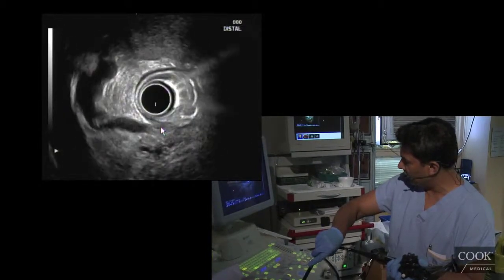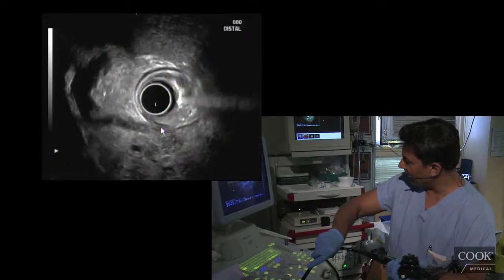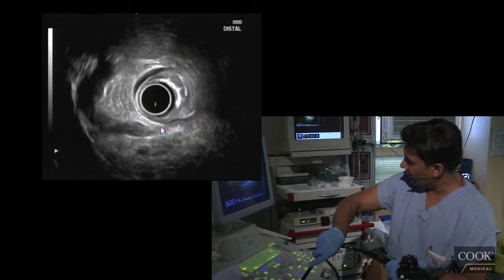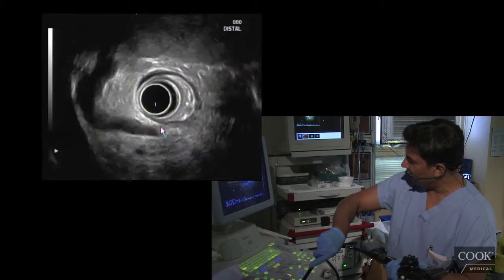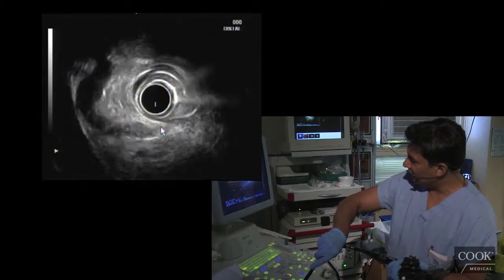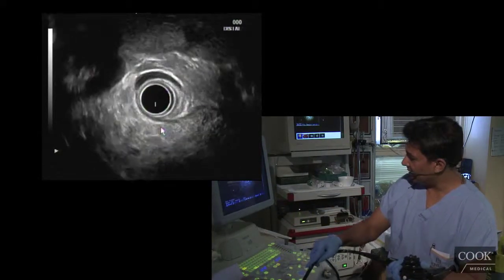Getting a nice long view. It is easier to get a longer view — actually, take that back. I think you can get a long view with the linear scope very easily as well. You just don't get the long view quite so often from the bulb like this. But we have a nice view of his bile duct there. So I think his bile duct is clean.